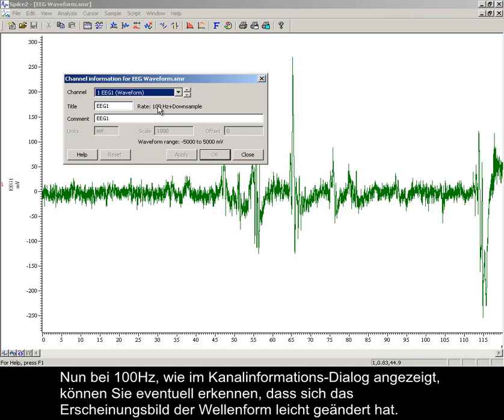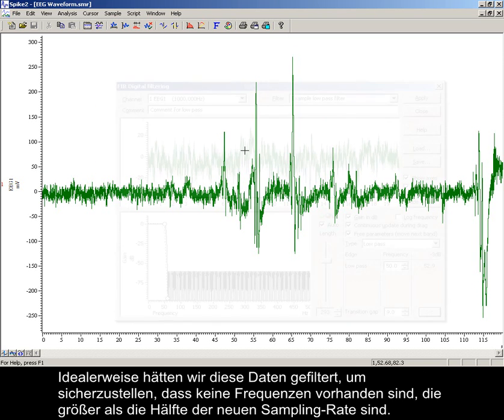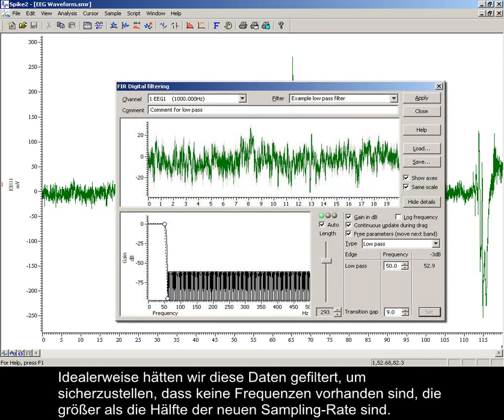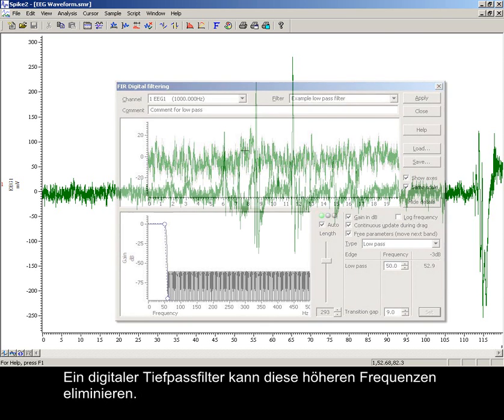Now at 100 Hz, as shown in the channel information dialog, you might notice there is little change to the waveform shape. Ideally, we would have filtered this data to ensure that there are no frequencies present which are greater than half of the new sampling rate. A digital low pass filter can remove these higher frequencies.